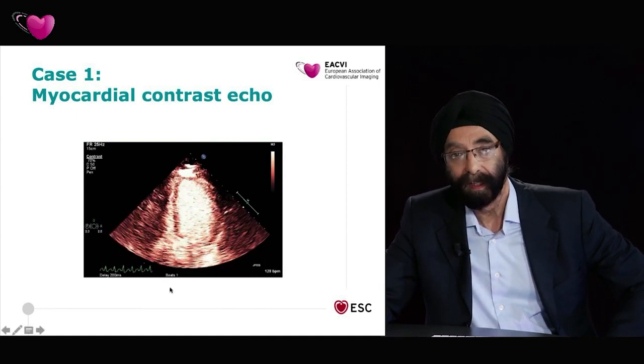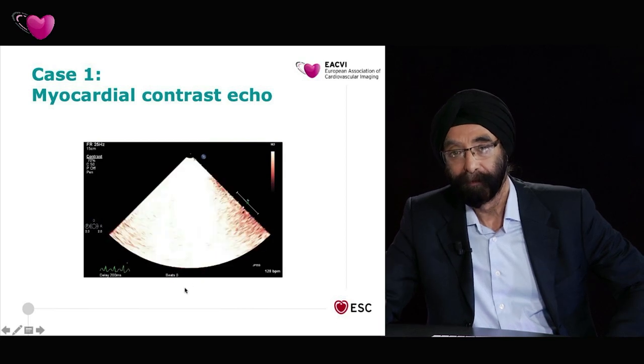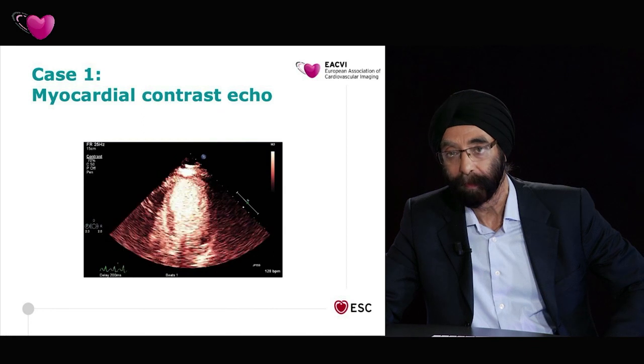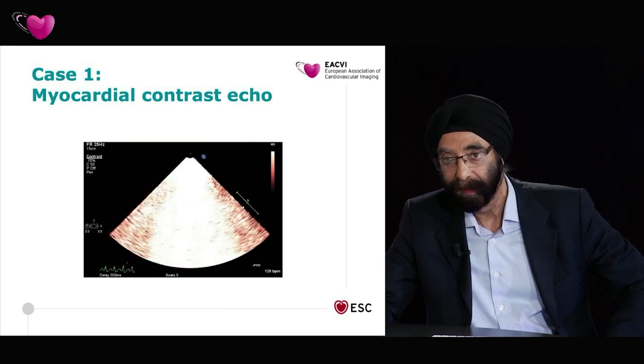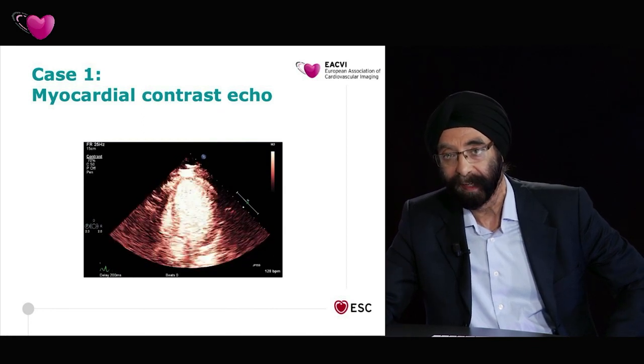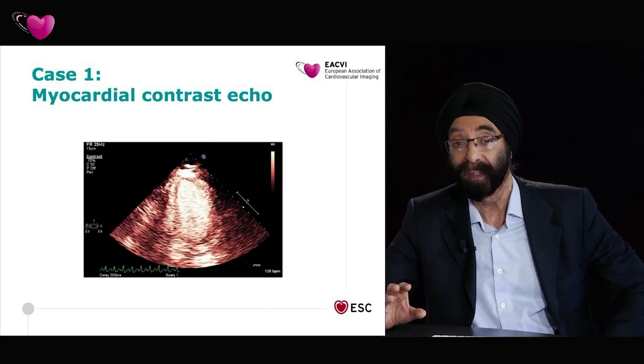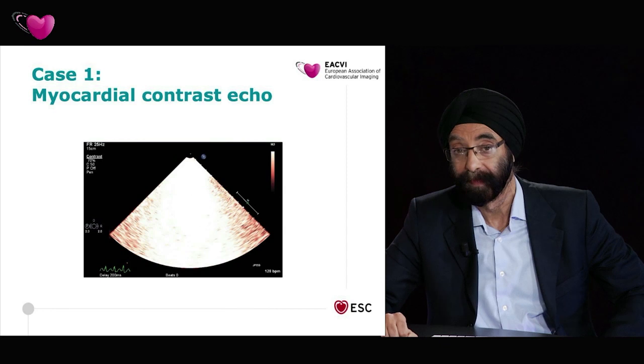And as Nicola has already described to you before, the flash indicates a high energy impulse which destroys the microbubbles in the myocardium. And then you'll note immediately after the flash, the myocardium goes black and then replenishes within 1 second.